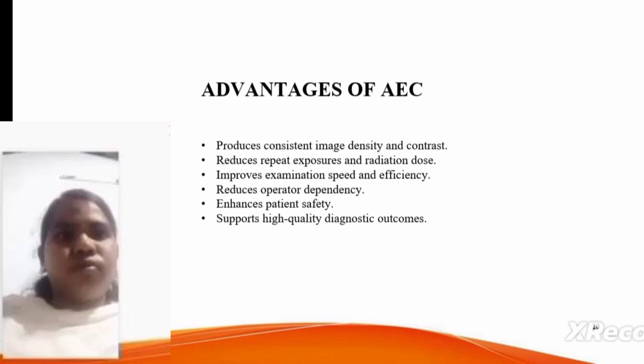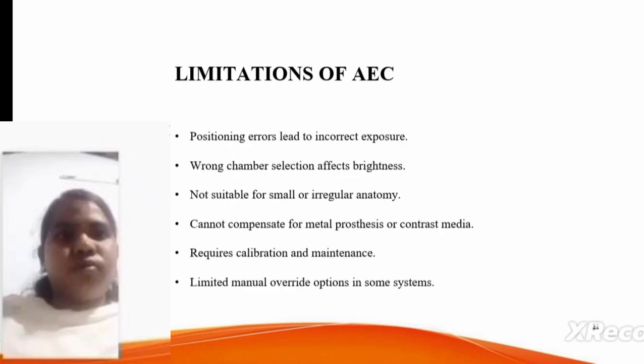Advantages of automatic exposure control: it produces consistent image density and contrast, reduces repeat exposures and radiation dose, improves examination speed and efficiency, enhances patient safety, and supports high quality diagnostic outcomes.